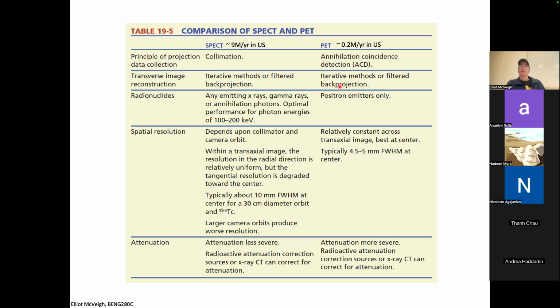It was a technique that had a forward model for how the photons would get out. Then you estimate the image, you create a signal using the forward model, and you look at the difference between the raw data you have and the raw data you created with your forward model, and say, how are those different?